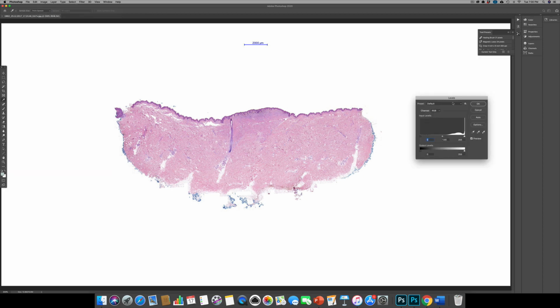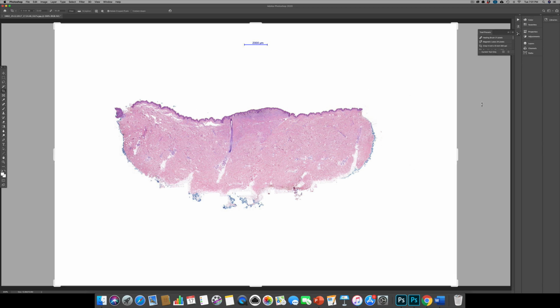And if you go across to the Levels box, if you click on the far right, and then use that dropper and put it near the specimen where you think it's not as white as it should be. Actually, this looks awfully good, so it probably won't do anything, but still, we'll do it anyway. So there we've clicked on it, nothing has happened, so that means that the white balance in this case was perfect.